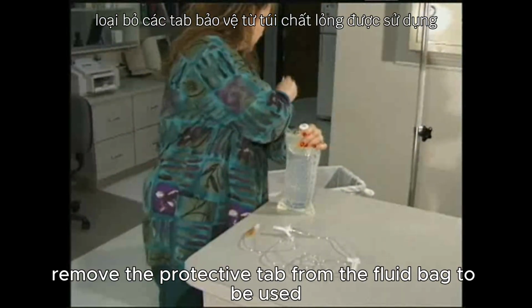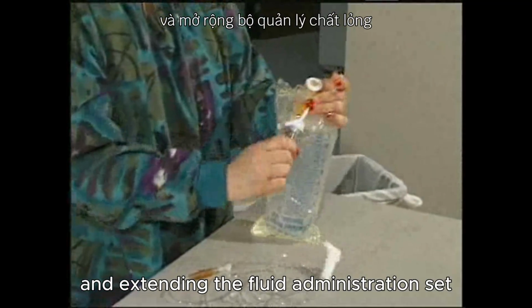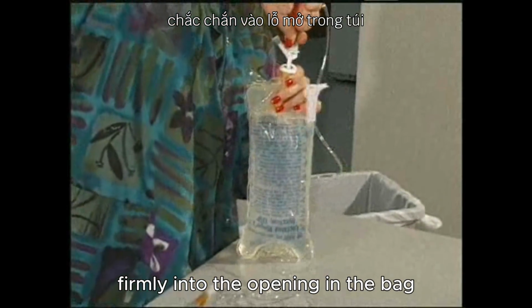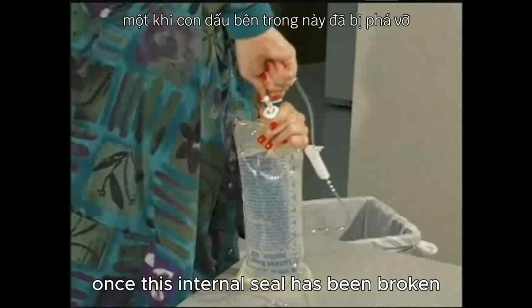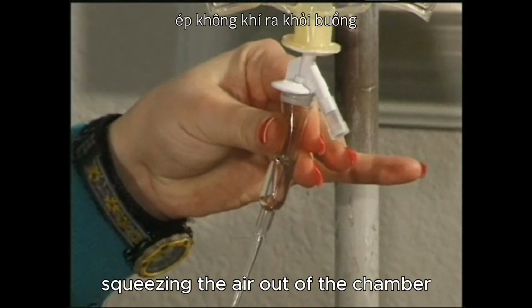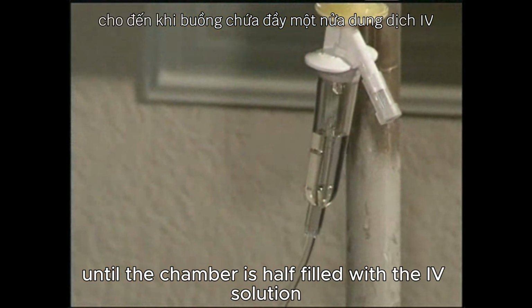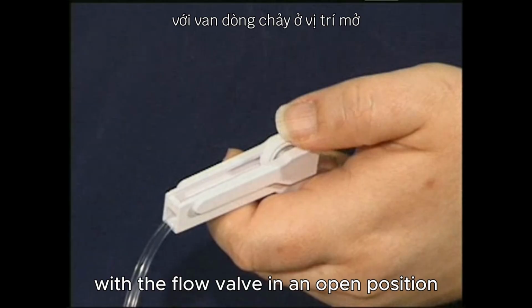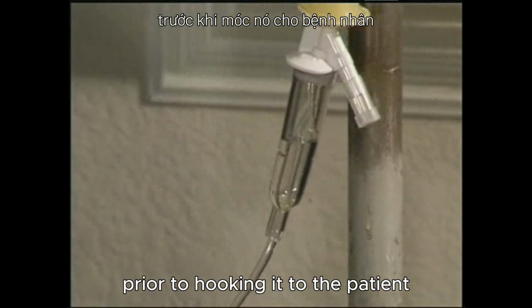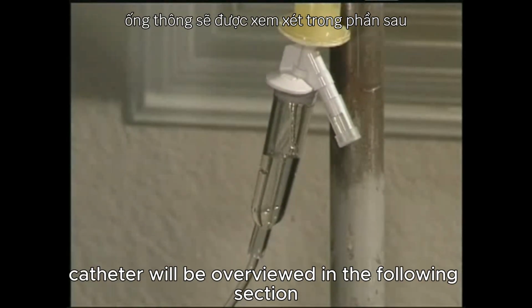Remove the protective tab from the fluid bag to be used. After unwrapping and extending the fluid administration set, insert the tip of the administration set firmly into the opening in the bag. Once this internal seal has been broken, the fluid will flow into the drip chamber. This should be aided by squeezing the air out of the chamber until the chamber is half filled with the IV solution. With the flow valve in an open position, allow the fluid to completely fill the tubing prior to hooking it to the patient. Proper insertion of an IV catheter will be overviewed in the following section.